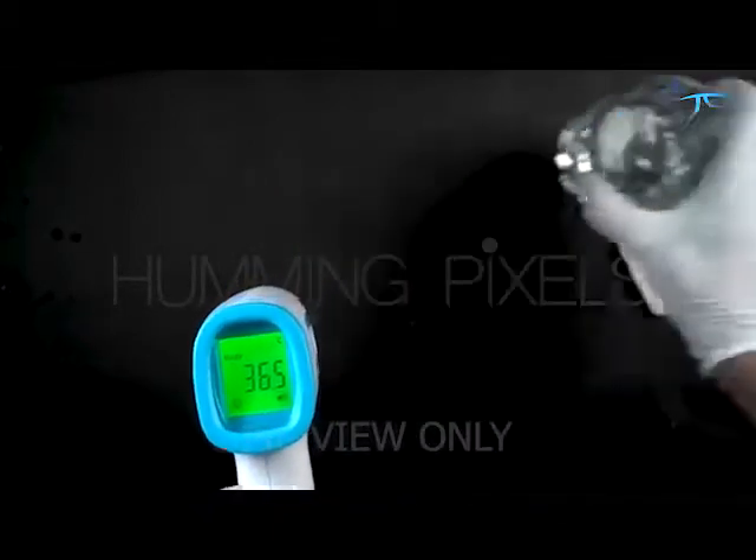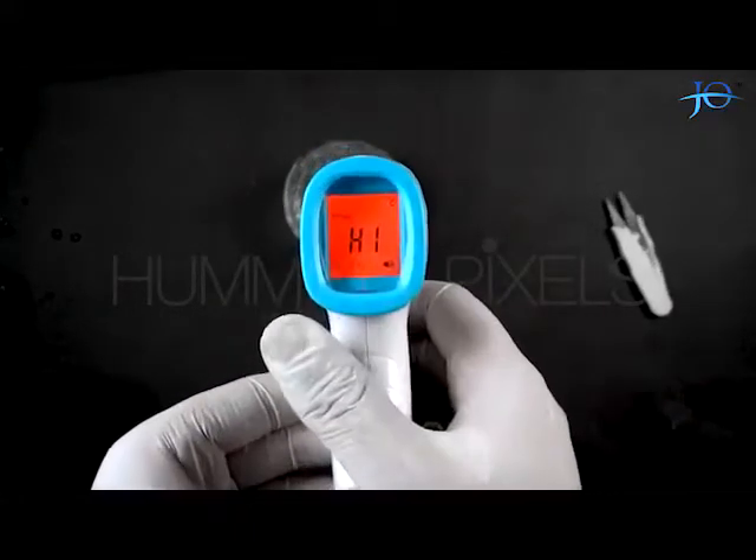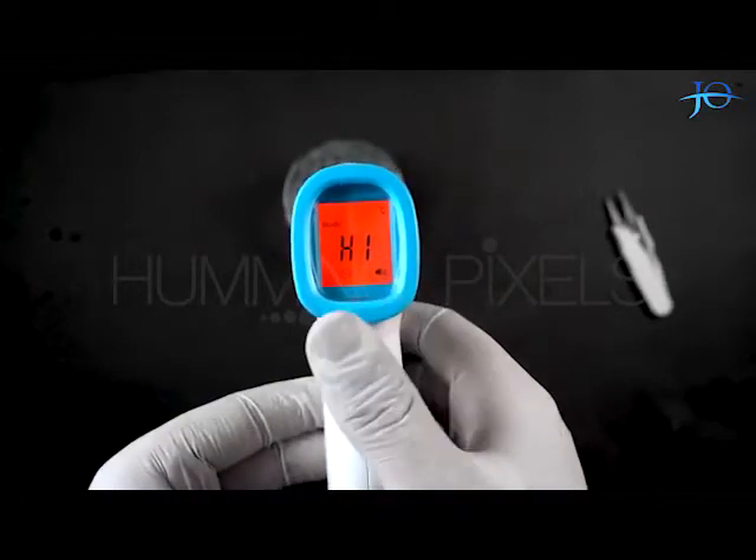Now I will use a cup of hot water again to see how it reacts to high body temperature. It is showing us red color along with a temperature warning. This indicates this is not a safe temperature.